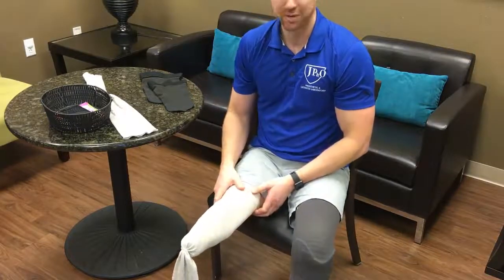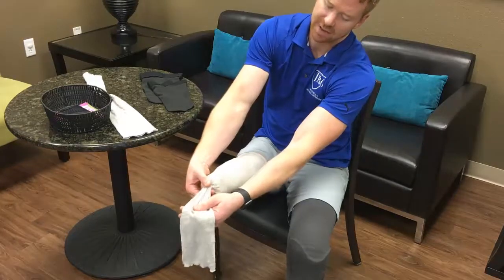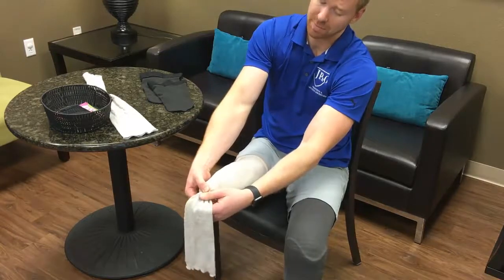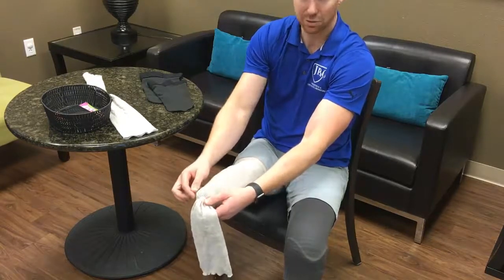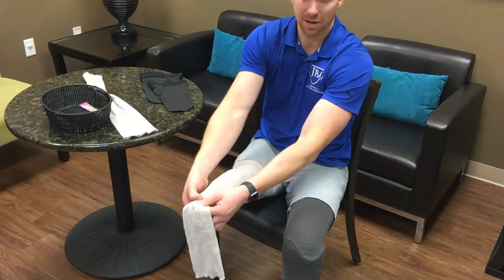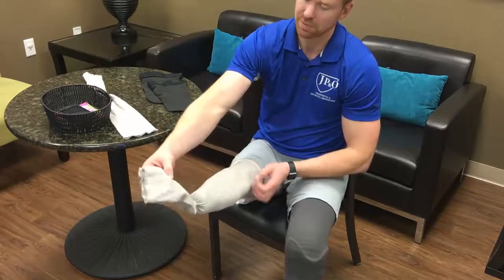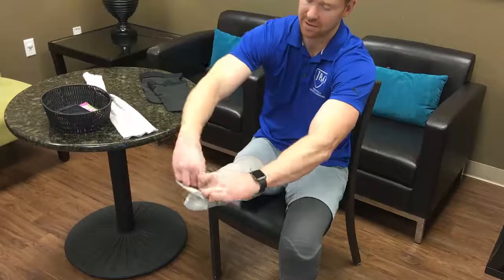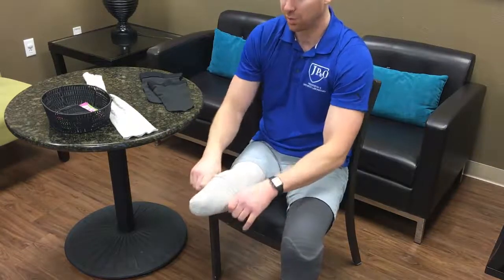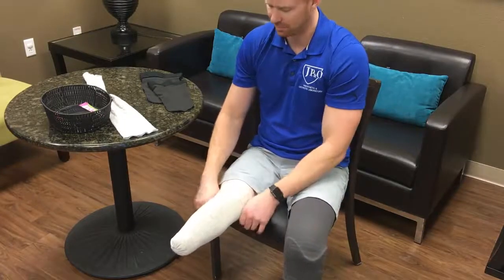The second thing we're going to do is find that ring, and slide it up all the way to the end of your residual limb. Now be mindful of any stitches or your suture line that you may have still, and you want to get it as close to the end as possible without causing irritation. The next thing we're going to do is reflect the second layer onto the first layer. And when we do this, we're providing more compression to the limb.